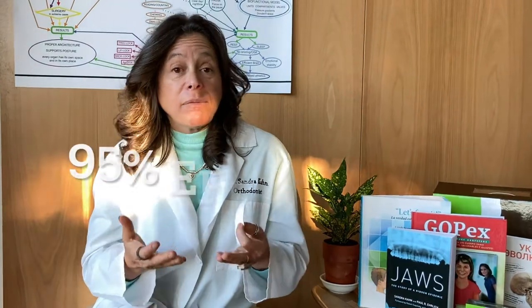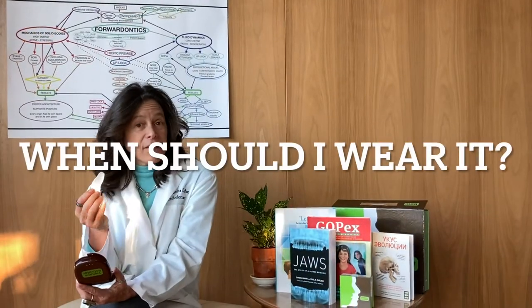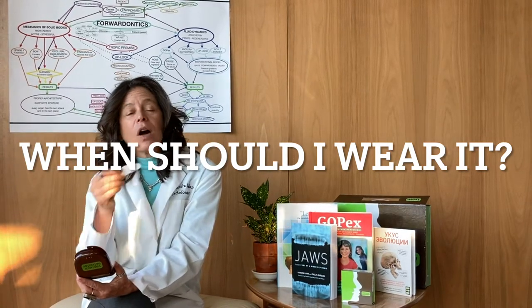You want to breathe 95% effortlessly, and for that you need to have anything that could bounce — anything that's soft — consolidated through that little suction in the top and front of the mouth, away from the airway. In my case, I like to use it when I work out. I do boot camp with weights a couple of times a week, so I always wear it. I also wear it when I'm driving or listening to music, and sometimes I'll wear it all night — and a lot of our patients do wear it all night.